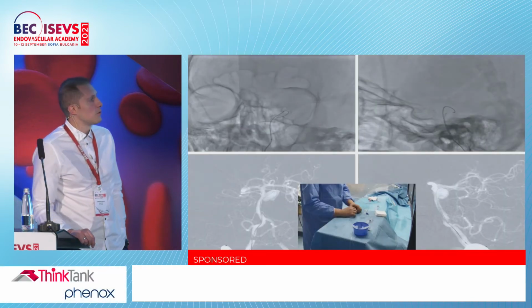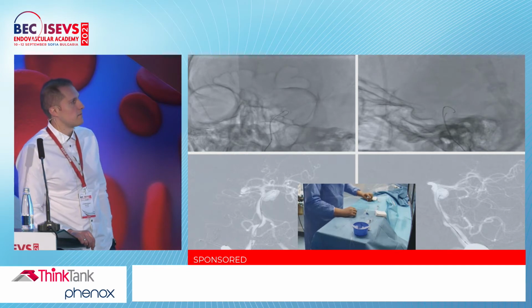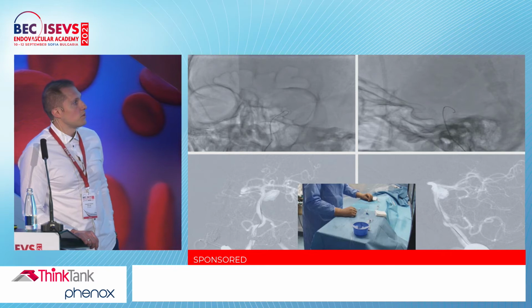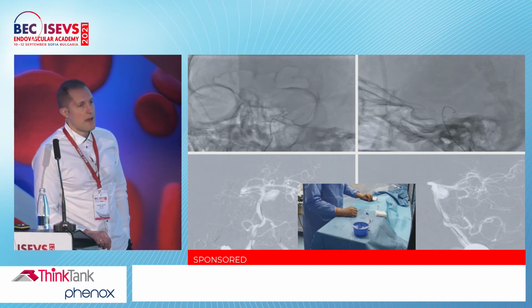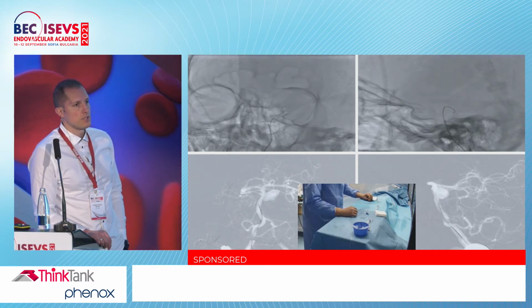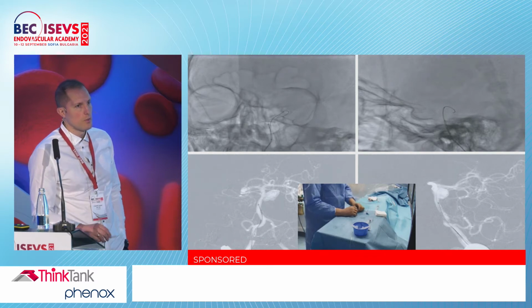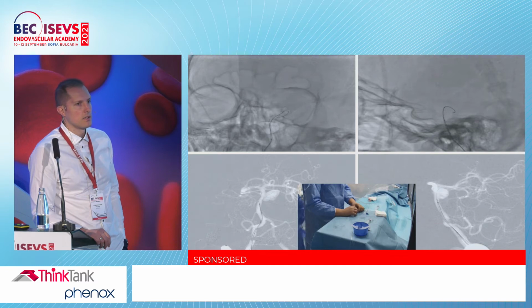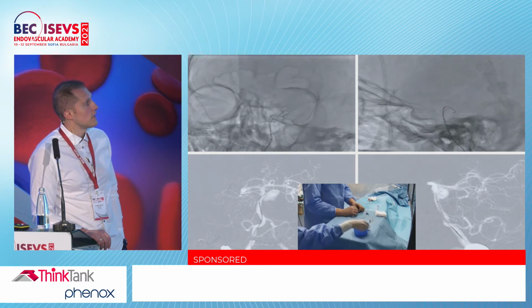On intra-arterial DSA, we saw the wide-necked mid-basilar aneurysm. Because it was acutely ruptured, we jailed a microcatheter inside with the idea to put several coils to induce faster thrombosis inside, to feel safer about the next days and to prevent an acute re-rupture of the aneurysm. This is the navigation inside with the first microcatheter.